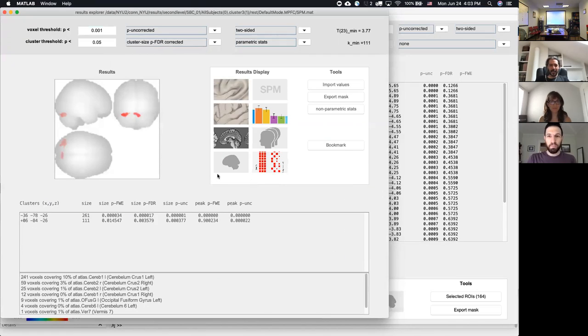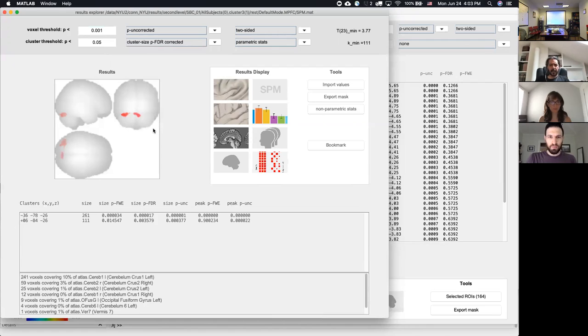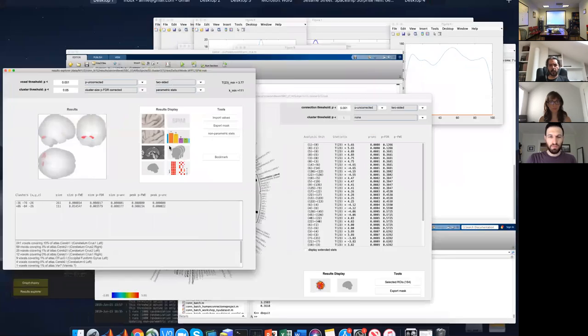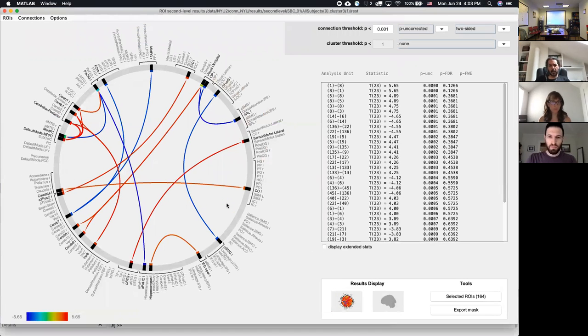Okay, cool. So that is that, and that's basically the random field theory stuff, and some of the Eklund stuff that was on top of that is the way, and that's the typical way to do analysis at the voxel level, and we do that also on our FL pipeline basically for any voxel level analysis. And there's one peculiar set of analysis that only arises in connectivity results that have to do with this kind of ROI to ROI.